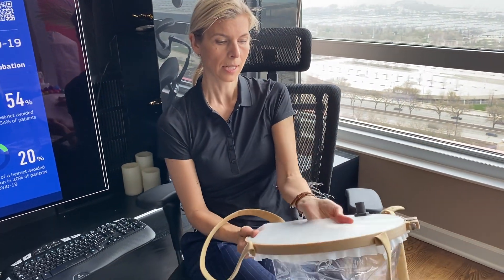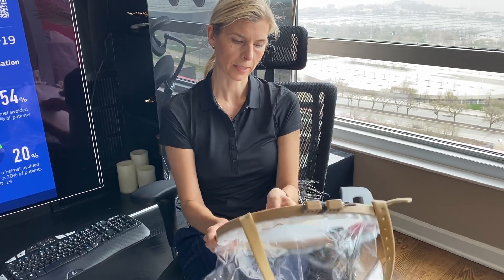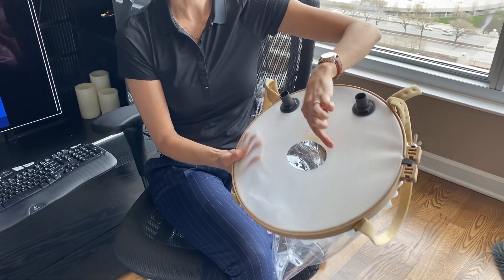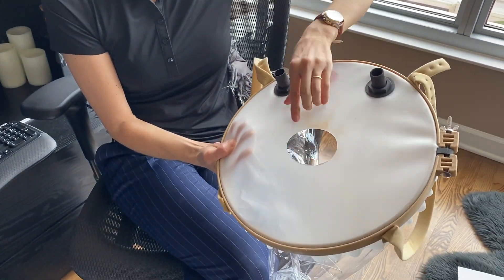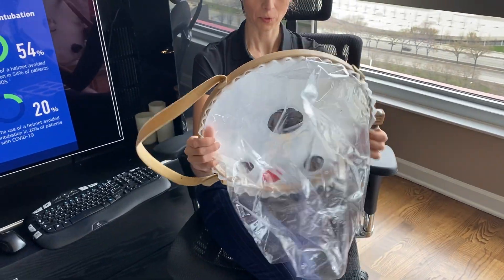This silicon part is soft and it is thick. I already cut, based on my measurements, a hole for my neck, and I'm going to put it on.